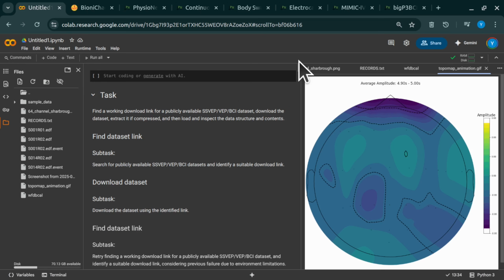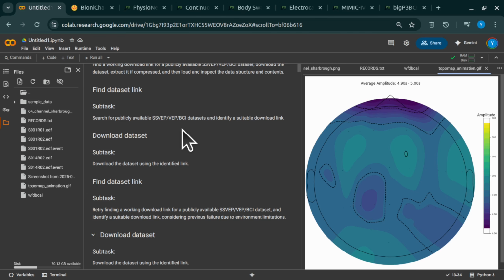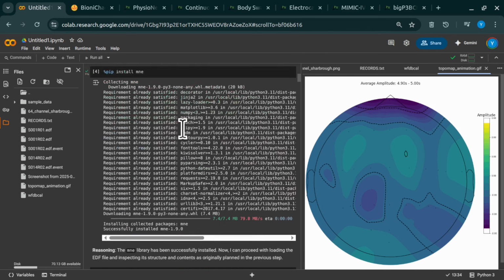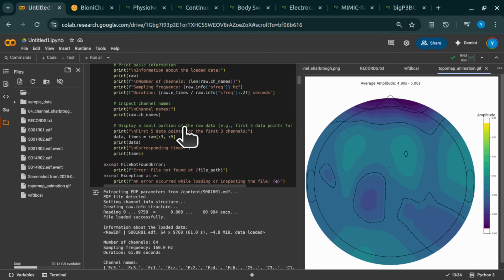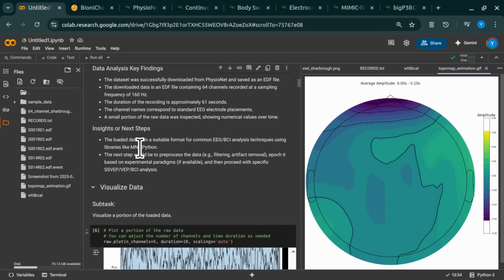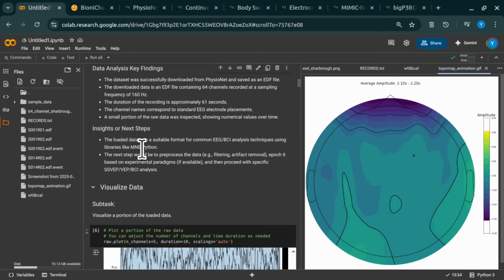Yeah, and it's not just about listing the steps, right? It's about seeing how you actually transform those raw, sometimes messy brain signals into something meaningful, something you can even visualize in a pretty stunning way. So the big question we're tackling is, how do you take these tiny electrical impulses, often buried in noise, and turn them into something you can actually see and understand?